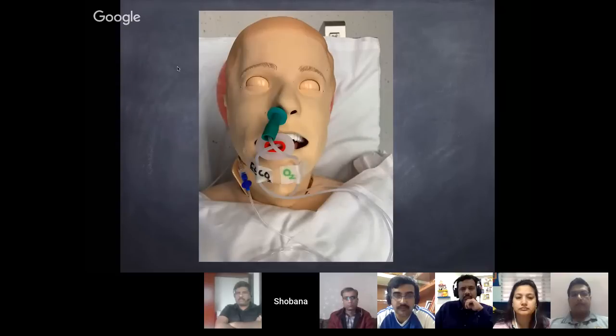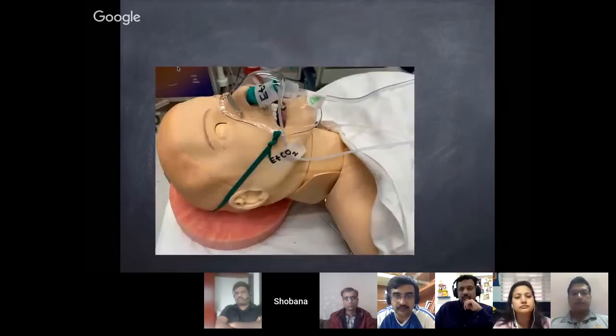I just want to show you some pictures of how we would handle the airway. So you could put in a nasal trumpet after putting in some nose drops, like phenylephrine nose drops, to make sure there's no bleeding. And then you can put in an oral airway as well and monitor CO2 through the oral airway and give oxygen and insufflation through the nasal airway. You could also put in a nasal trumpet and then monitor EtCO2 like that, and administer oxygen through a face mask if you think that the patient requires a higher amount of oxygen.